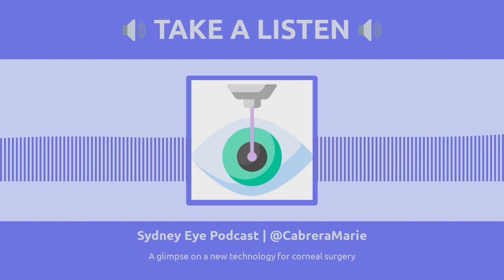So the laser beam that we use to so-called color or shade the patch has a footprint of about 1mm. So we just have to move it around the patch until the whole patch is covered. And that varies between 45 seconds to about a minute. So very quick, considering each cornea suture can take you a few minutes.